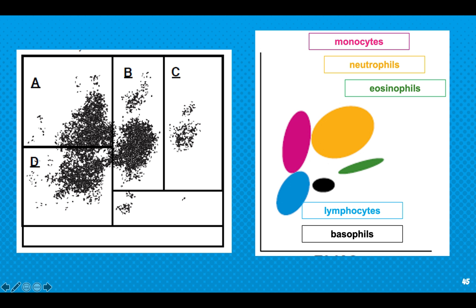So technically, sir, let's continue: how can we use your histograms and your scatter plot in quality control in hematology? By merely looking at this one, you will now be able to see which are those that need to be manually checked. If your histogram, if your scatter plot is appearing very strange or different than the usual, than the normal, you have to double check it. Either it is really your sample which is the problem, or maybe there are some disturbances in your machine or deterioration in your reagents and even the quality of the blood collection. So you will be able to see it there.